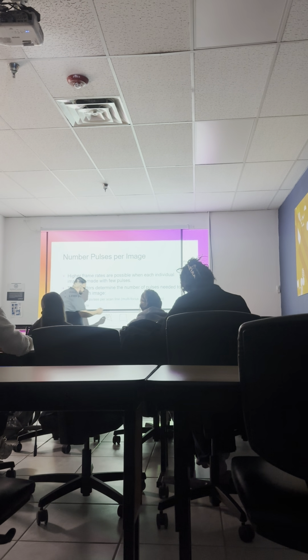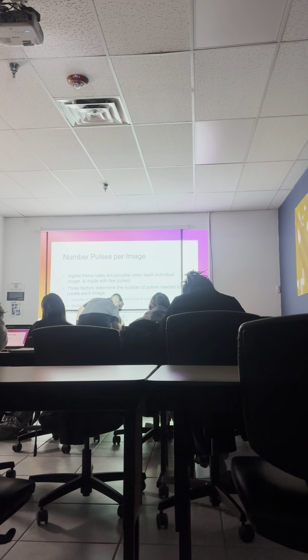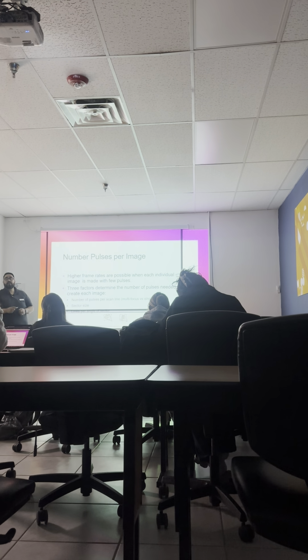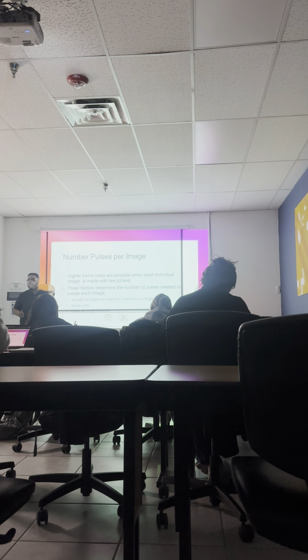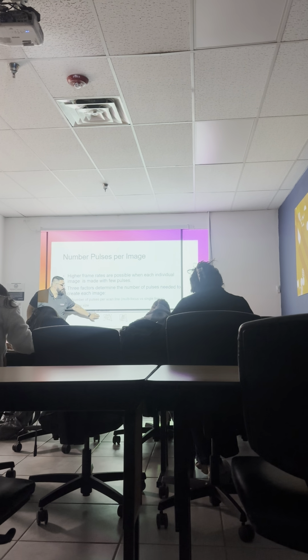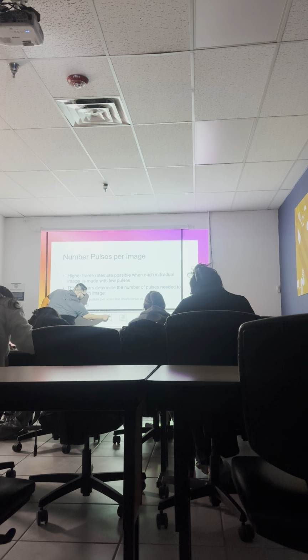Okay, so let's say the line density is like this. Which one's gonna look more accurate? The right one? This one? Yes. This one's gonna look more accurate because there's more scan lines, right? It's going through each section of the liver. This one, we can still see the liver, but it's gonna look kind of blurry, right? That's because it's missing information in between these lines.